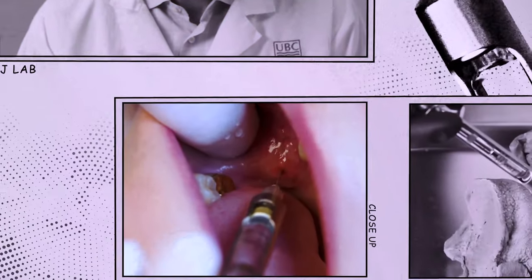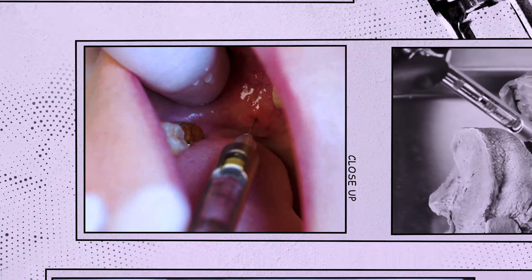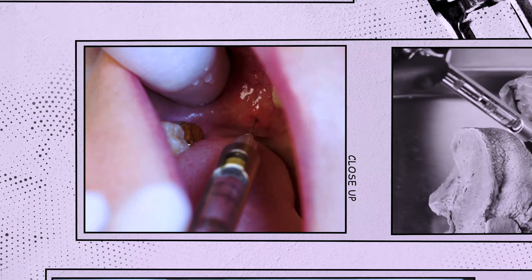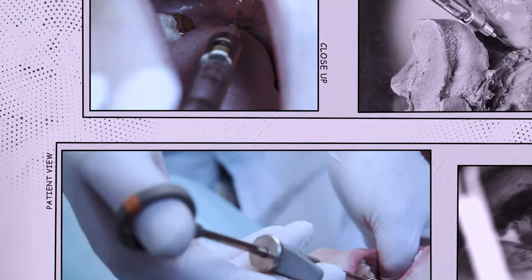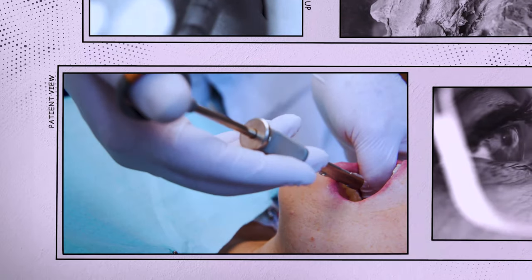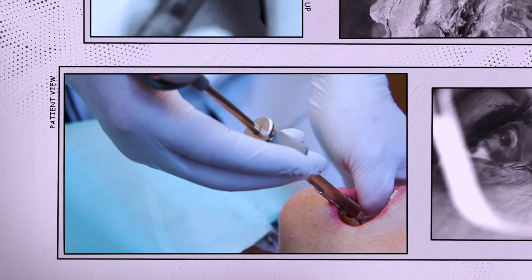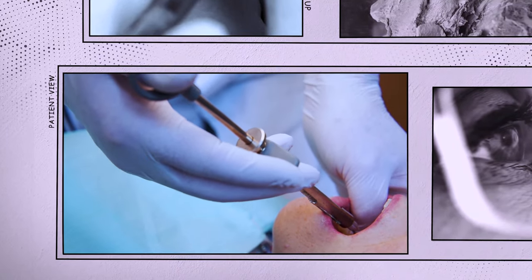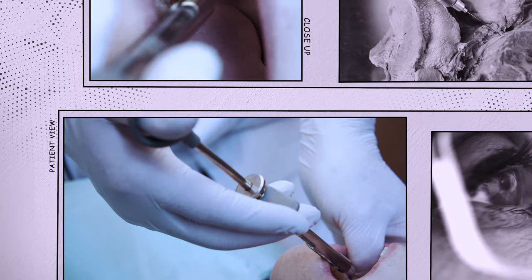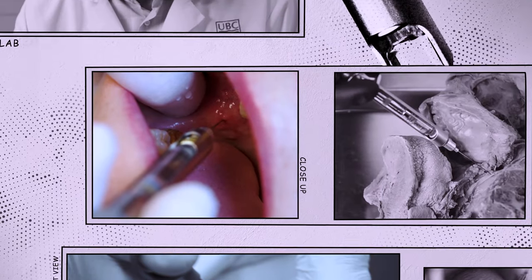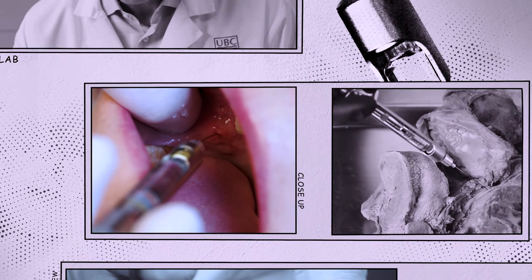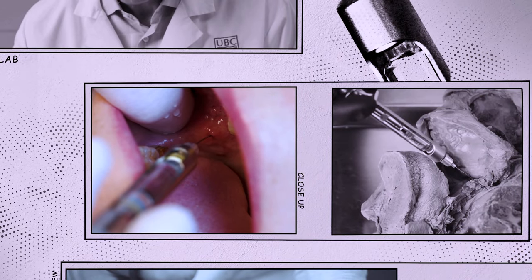If this happens, don't panic. Leave the needle within the tissue, withdraw slightly, and move the syringe barrel towards the front of the mouth. This will reposition the needle tip towards the lingula.